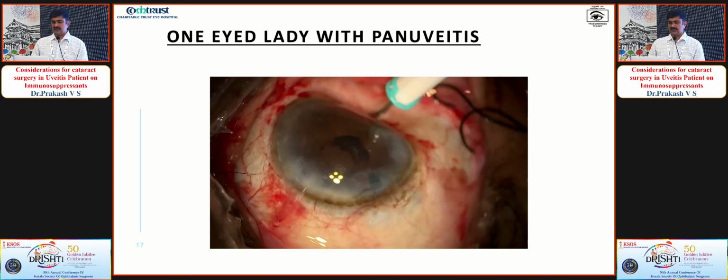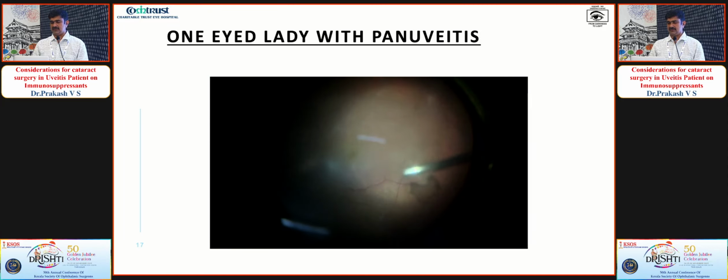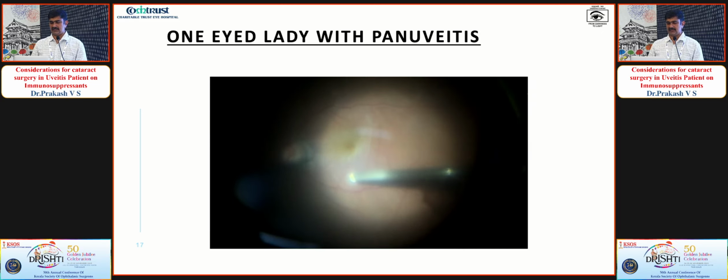I have removed the ring. The ring can be kept till the end of vitrectomy surgery also, but I removed it in this case. If I have to use a tamponading agent, there is a risk of it coming into the AC, so I removed it because there was sufficient pupillary dilatation.